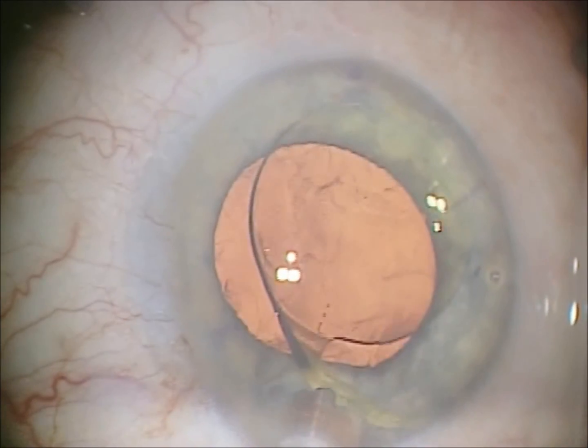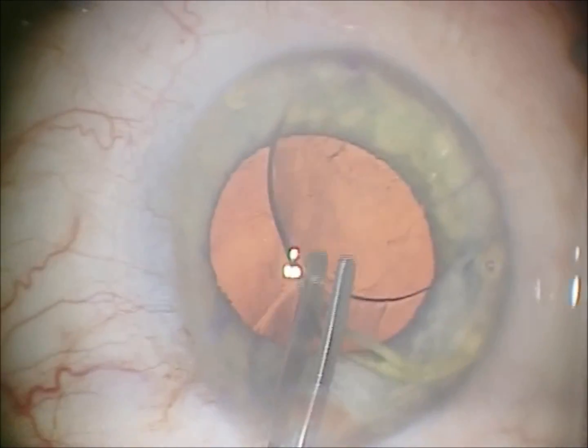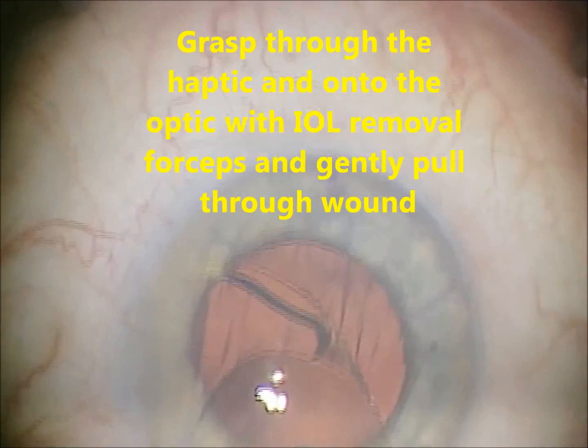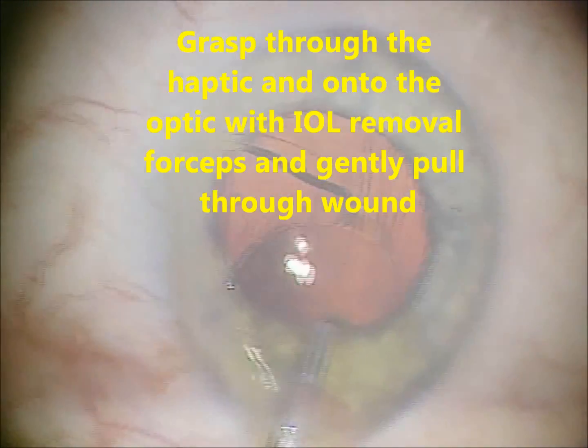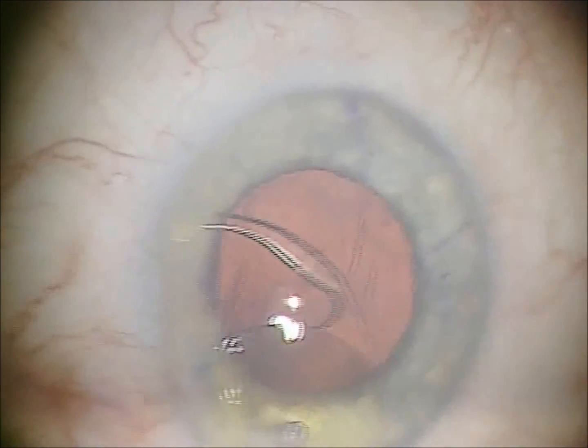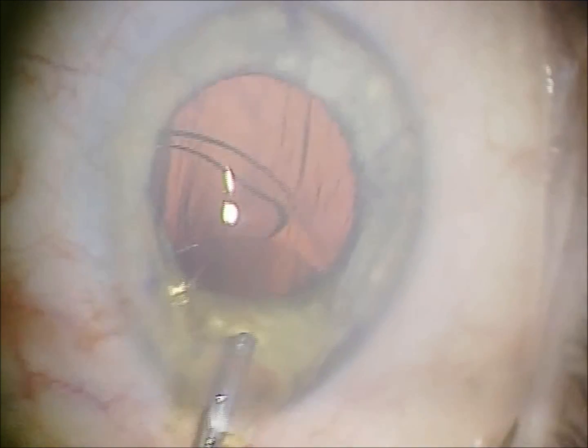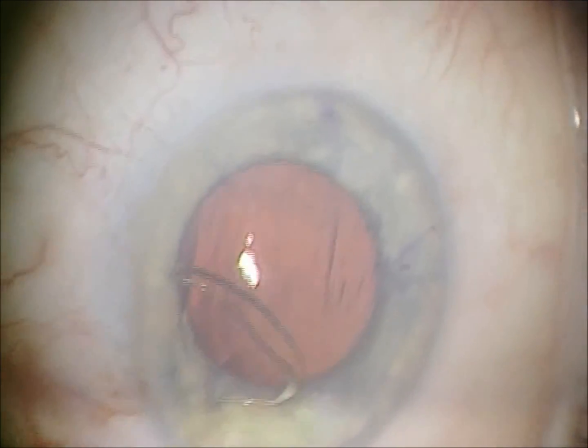A tooth or alligator type lens removal forcep is used to gently but firmly pull the lens through the wound. It will just form-fit through the wound and pull on through with just gentle pressure. And that's all it takes — no cutting.